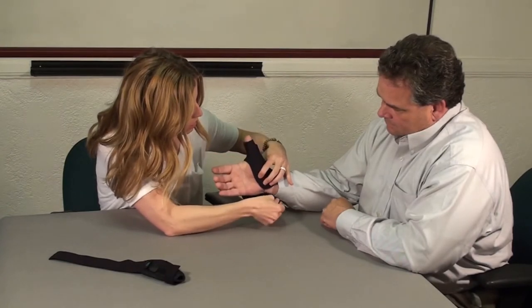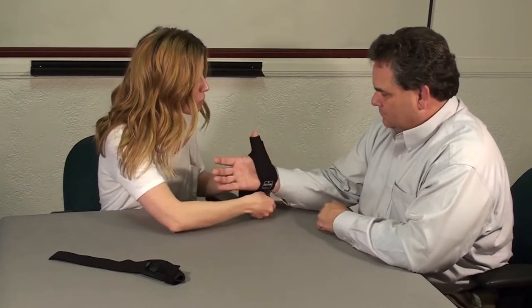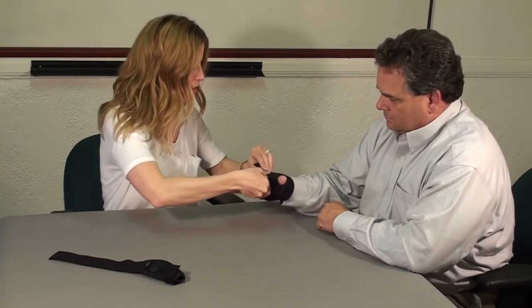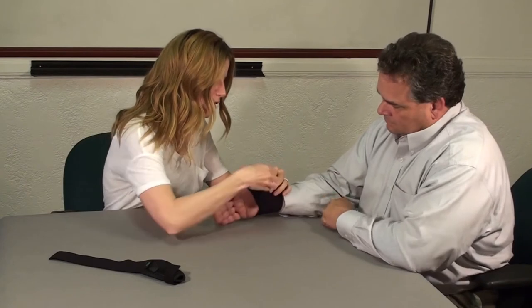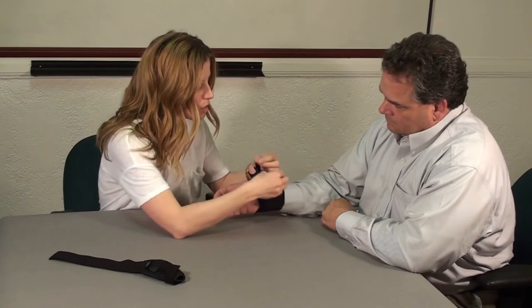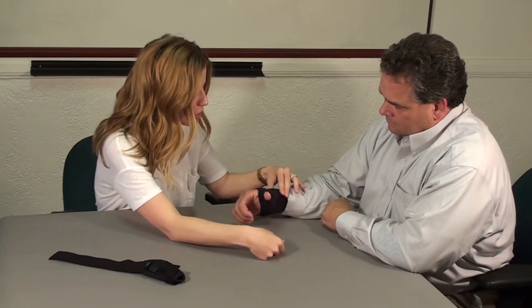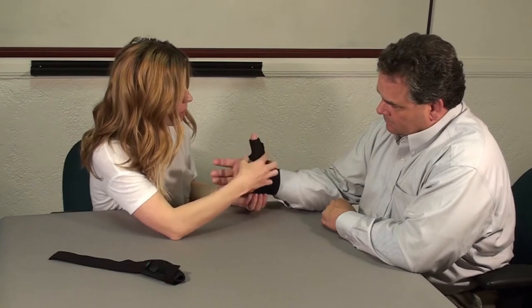This is what we call our patient assist strap, which makes application so much simpler for the patient — you're not worrying about the splint translating around your wrist as you apply the wrap. In the stay pod, you'll notice there are two stays: a spring stay and a straight stay, so you can customize that to whatever the patient needs for the particular diagnosis you might be treating. Does that feel comfortable? Very comfortable, especially if we trim that down.